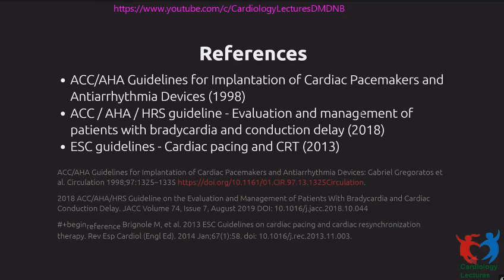There are some trials ongoing on whether every patient undergoing a PPI should have pacing in the His bundle region. Right now, I would say there's no strong evidence, and there are some downsides of His bundle pacing, like higher thresholds and higher risk of lead dislodgement. So right now, I would not recommend that, but that is something that could change in the future.